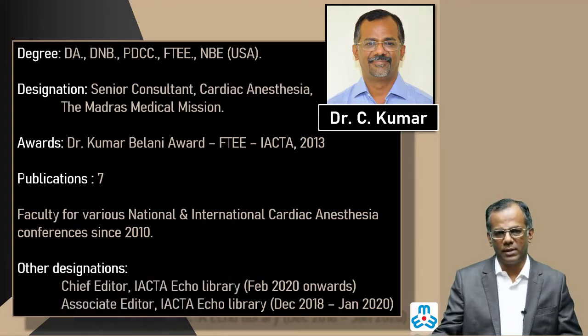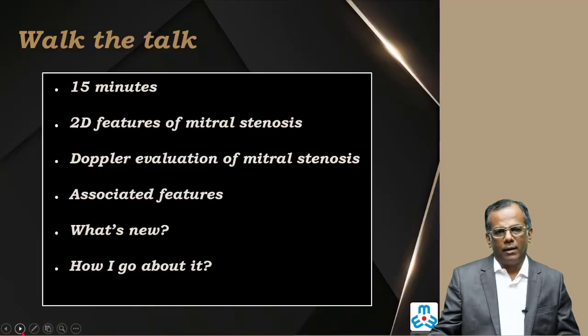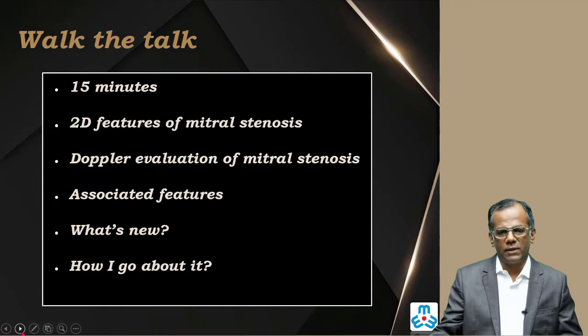Before this elite audience. Today, I would be talking about 2D analysis and Doppler echocardiography in mitral stenosis. It will be a 15-minute talk. I'll be talking about 2D features of mitral stenosis, the Doppler evaluation of mitral stenosis, the associated features, what's new, and how I usually go about it.